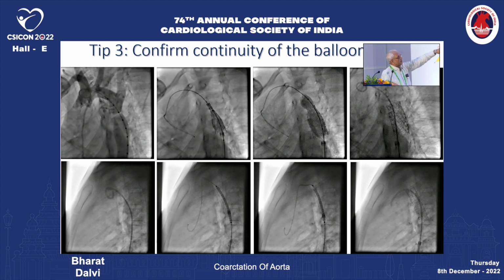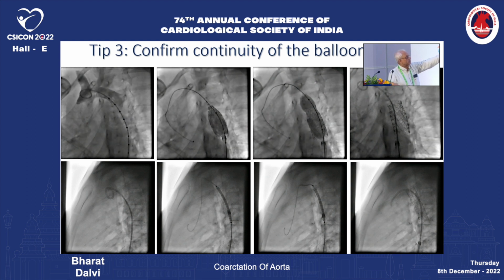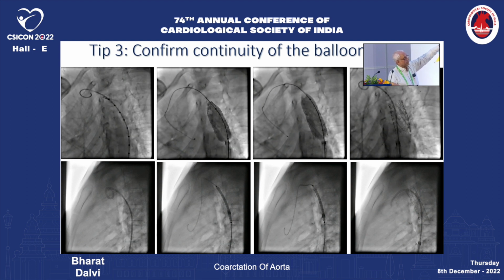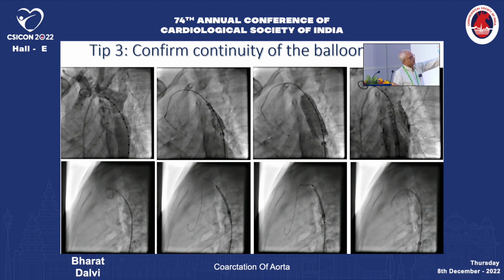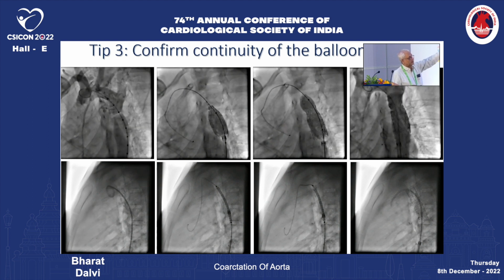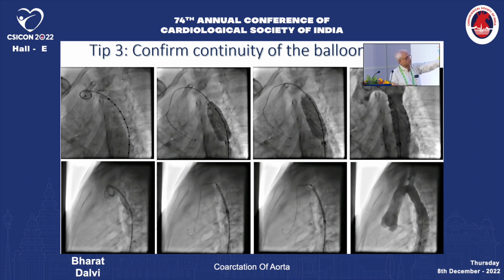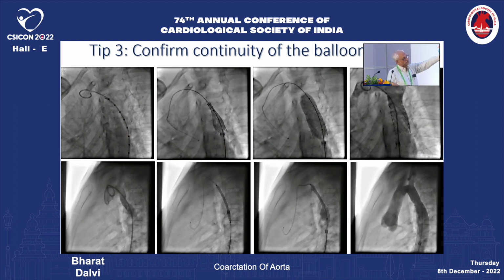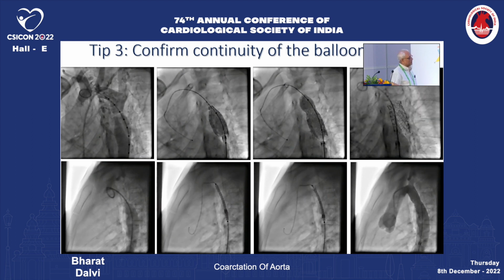Okay. Now this is a case, you can see that. What is happening in the second frame is that actually the balloon is slipping, the stent is slipping, only the proximal part of the balloon is getting dilated. And when this thing happens, there is a chance that the stent will go distally. We were fortunate in this that we managed to get the stent right in position and get an excellent result following stent deployment.